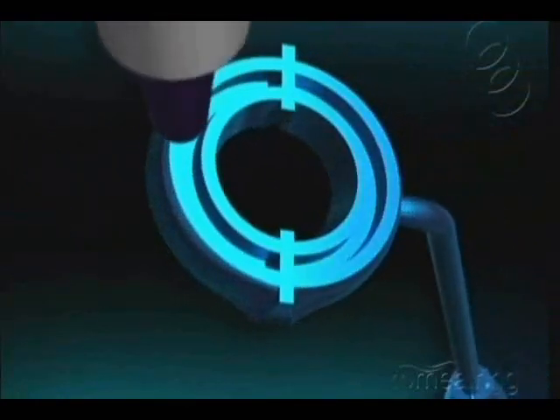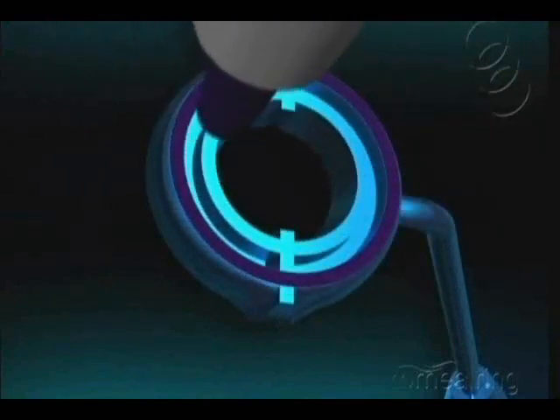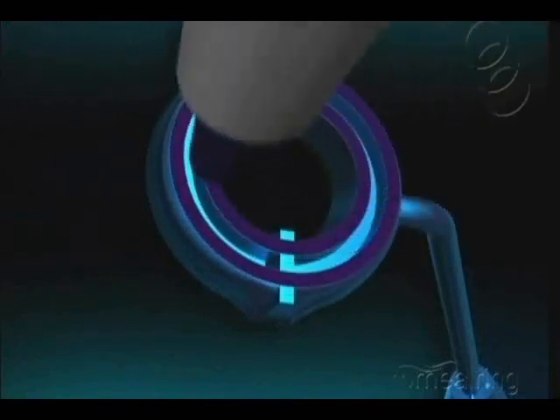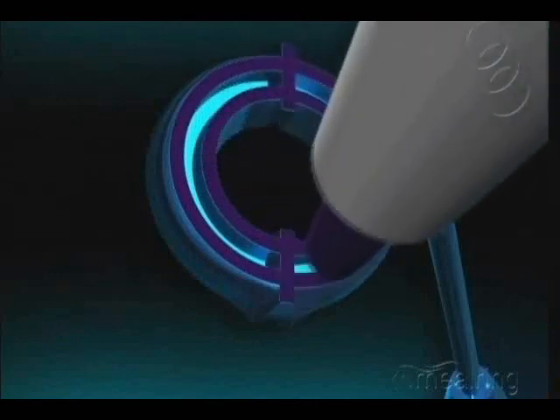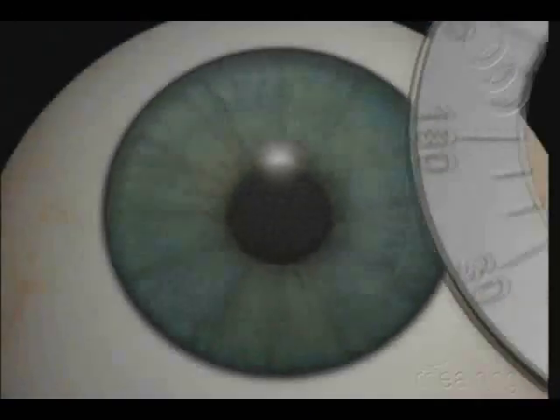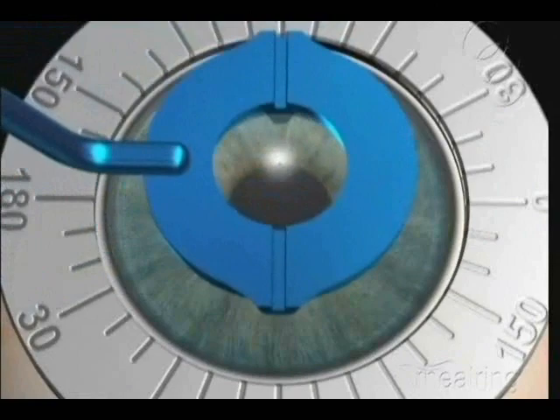The marker should be inked with gentian violet using a marking pen. Dry the epithelial surface using cellulose sponges to make precise marks. Then mark the tunnelization zone and the steepest meridian.